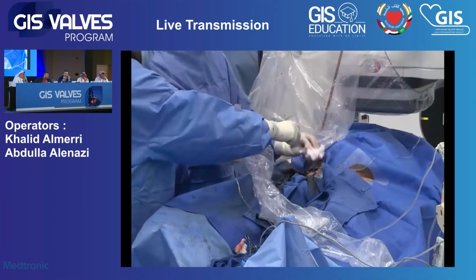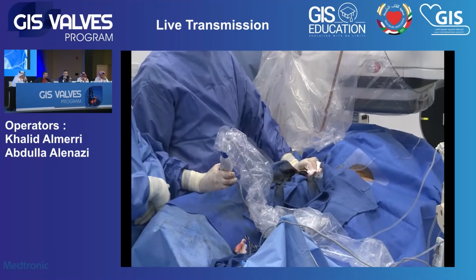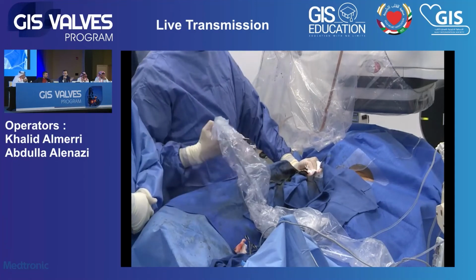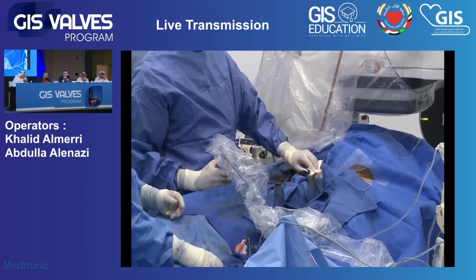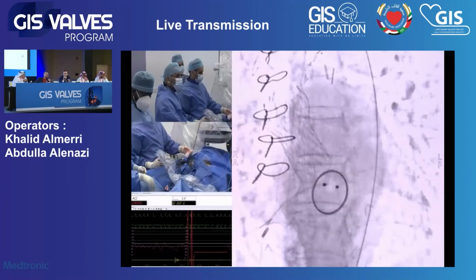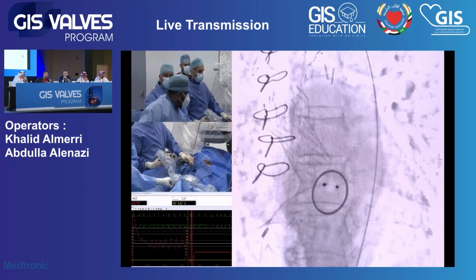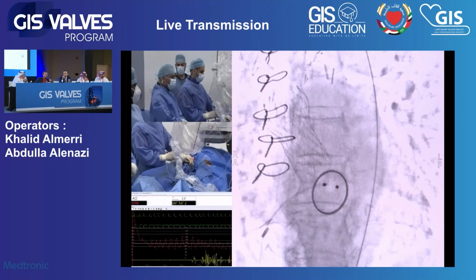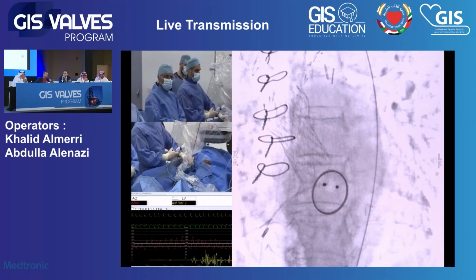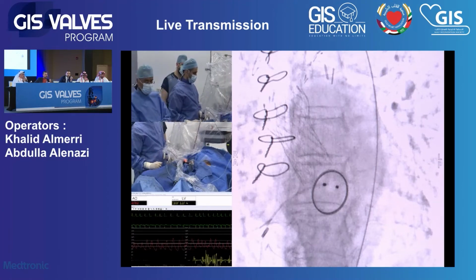So, yeah. Can I make one comment about the commissure alignments? In every valve, there are criteria now and guidelines on how to do the commissure alignment. We all agree that it's done in the bicuspid valve. For the CoreValve itself, I think it's very clear how to do it. But for the other valves, I think we need to be trained. There is a learning curve. And again, for the same reason that in the future we'll be using it in young patients, we need to make sure that we have coronary access. Commissure alignment is the key to making sure that we do have coronary access when somebody presents with acute MI.